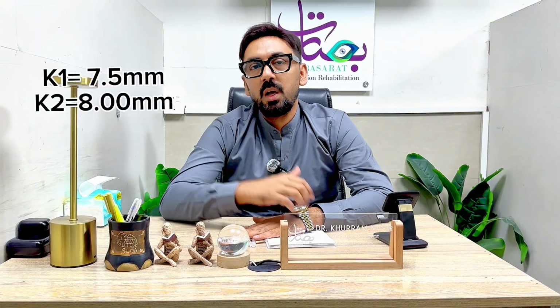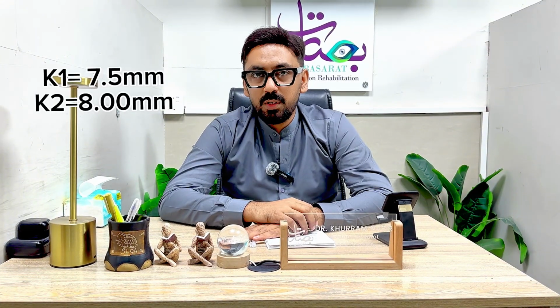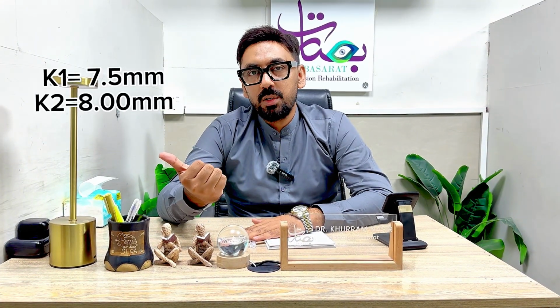We will get K1 and K2 readings, right? K1 and K2 mean one meridian is the steeper meridian of the cornea, and the second one is called the flatter meridian of the cornea, right? So we will take the flatter meridian as the base curve of the contact lens. For example, K1 is 7.5 millimeter and K2 is 8.00 millimeter. You know very well that 8.00 is flatter than 7.5. So 8.00 will be my patient's initial base curve, right?